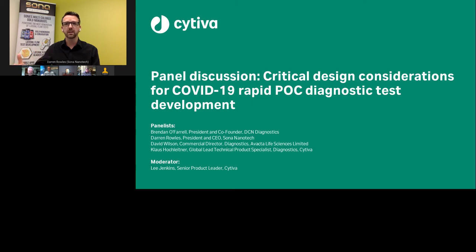So I think screening tests like the ones that we're all trying to develop here, whether antigen or antibody based, certainly have their role to play. And as we've alluded to before, that risk-benefit trade-off is the main key thing. But again, coming back to some of those technical challenges, the sensitivity is going to be the major issue, and there is that specificity issue around cross-reactivity and interference with the existing SARS-based viruses that are floating around in the environment.